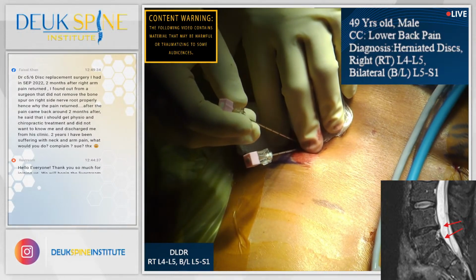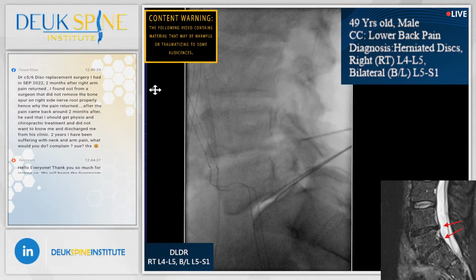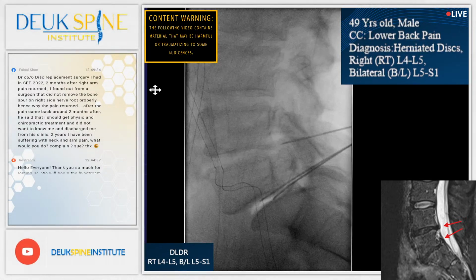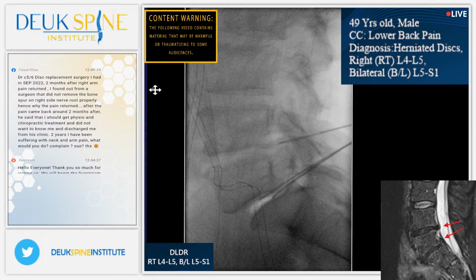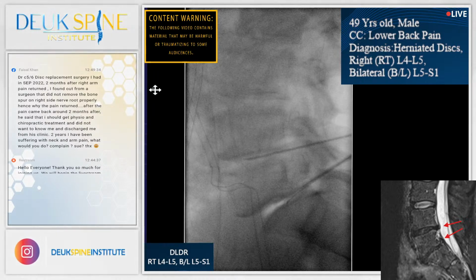He's very thin. His spine is quite posterior. Where do you feel it? Lower right side. All right. But not down your leg. Where do you feel it? Lower back? Okay, not down his leg. That's important. All right, are you comfortable?